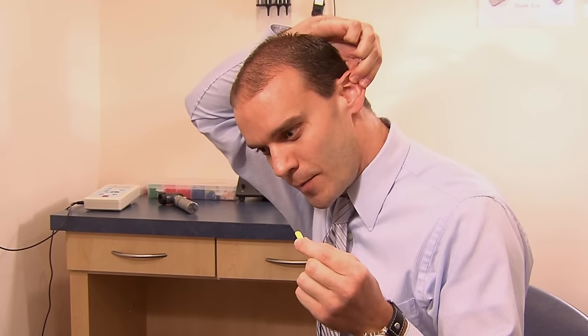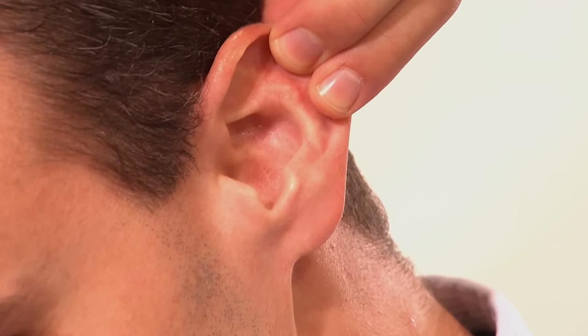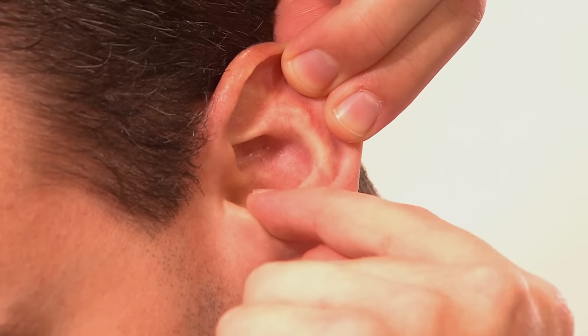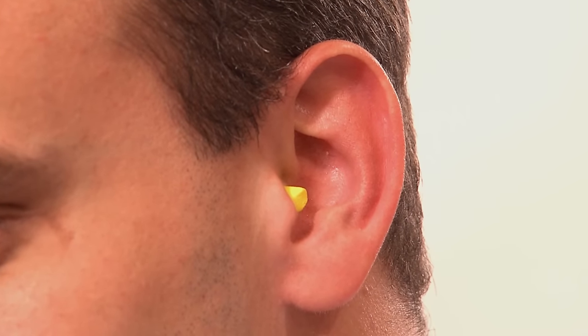Using the hand of the ear you're going to insert it in, reach around with your opposite arm to pull up and back on the ear canal, then place the ear plug into the ear and allow it to expand so that a tight seal can be produced in that ear canal to provide the most comfort and the most consistent noise protection available.